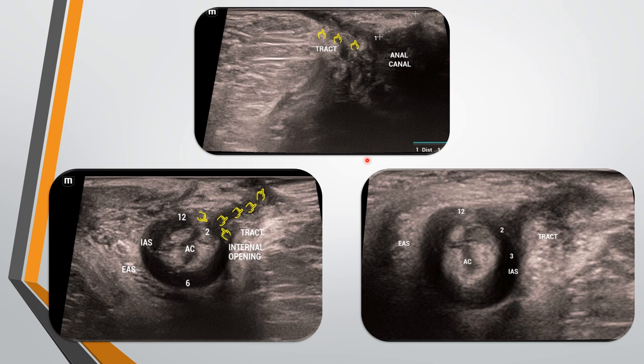In the next case, the linear probe was kept on the external opening site. A linear tract is seen arising from the anal canal and opening into the external opening site. In axial sections, the tract arises from the anal canal at about 2 o'clock position. The internal anal sphincter and external sphincter are identified. The tract courses laterally and opens into the external opening site — this also has a transsphincteric course, with mild fluid noted adjacent to the tract. This is a transsphincteric type of perineal fistula.